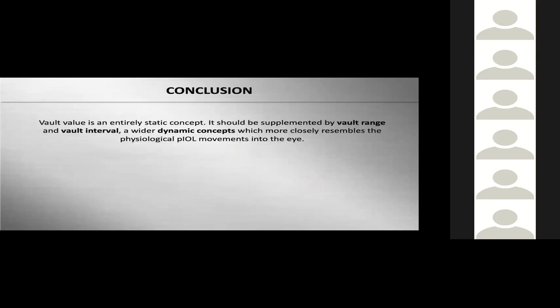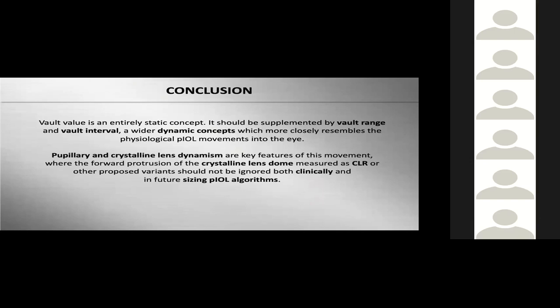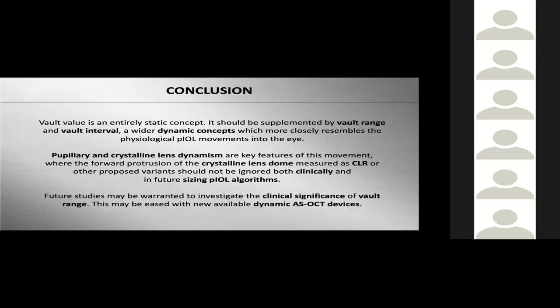So in conclusion, first and foremost, our findings underline how the anterior ocular segment is in continuous motion according to the intensity of external ambient light, which modulates the measurement of postoperative vault. Vault value is an entirely static concept. It should be supplemented by vault range and vault interval, a wider dynamic concept which more closely resembles the physiological phakic lens movements in the eye. Pupillary and crystalline lens dynamics are key features of this movement, where the forward protrusion of the crystalline lens dome should not be ignored. Future studies may be warranted to investigate the clinical significance of vault range.